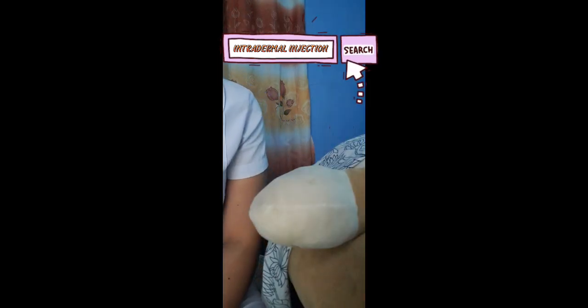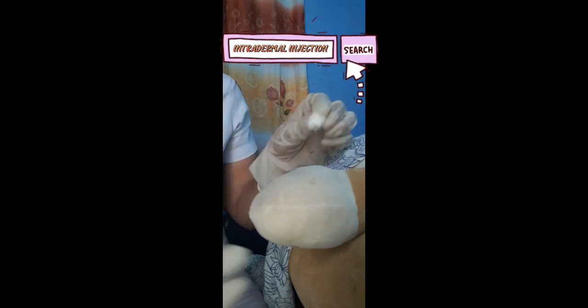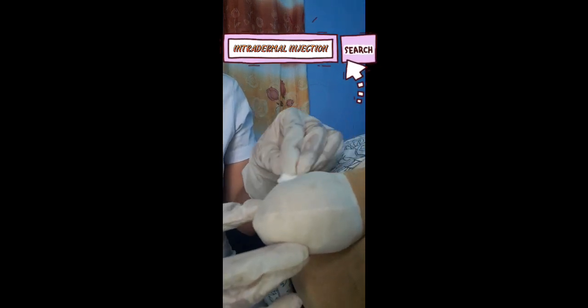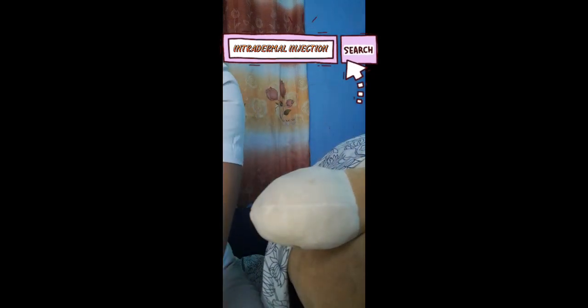Now use an antiseptic swab to clean the site, beginning at the center, circling outward about 5 cm. Discard the swab.